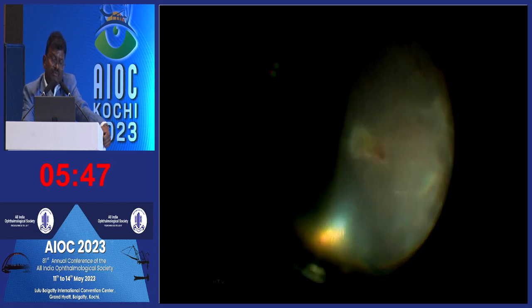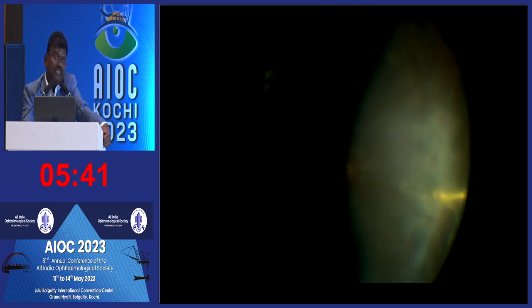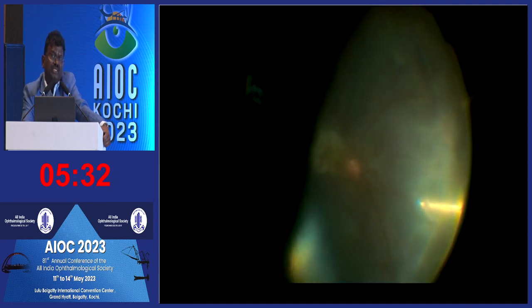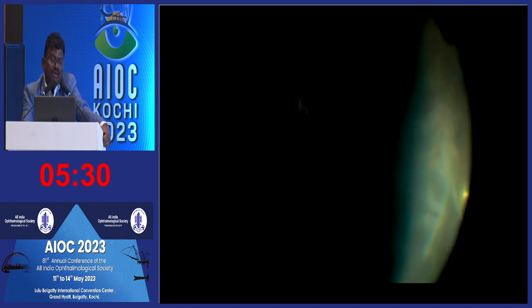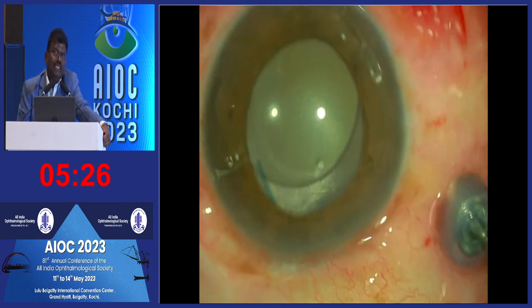This is the second band which we have removed, and there is a napkin ring around the disc. This is the one which is very difficult to remove, because we have to make a retinotomy, and that leads to migration of the PFCL. Once this is done, now you can inject the PFCL, settle the retina, and the gliotic tissues can be dealt with in a conventional way.